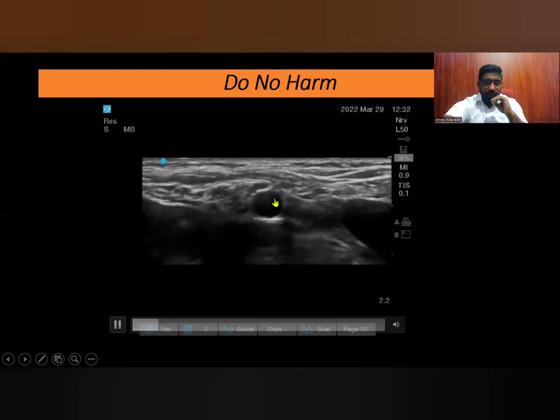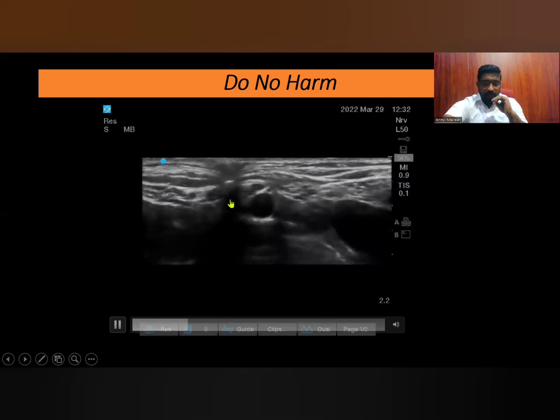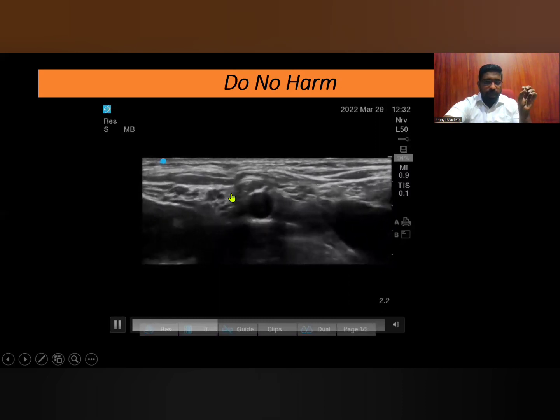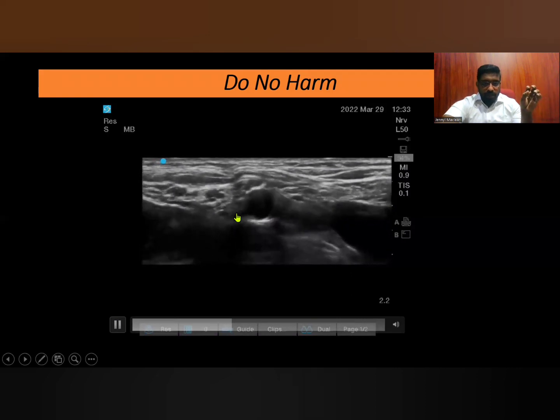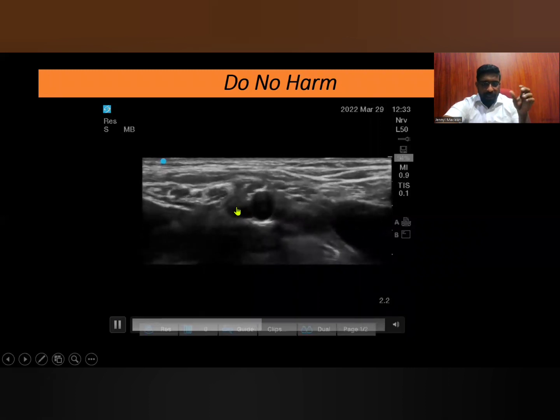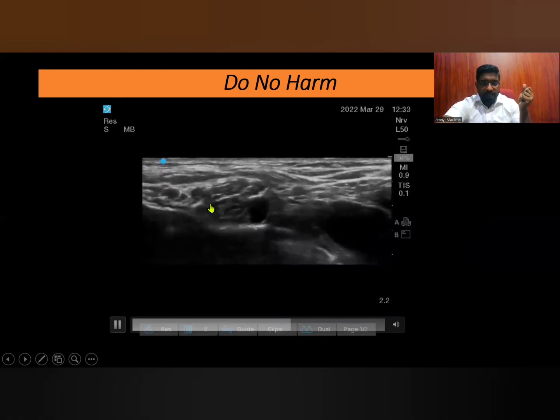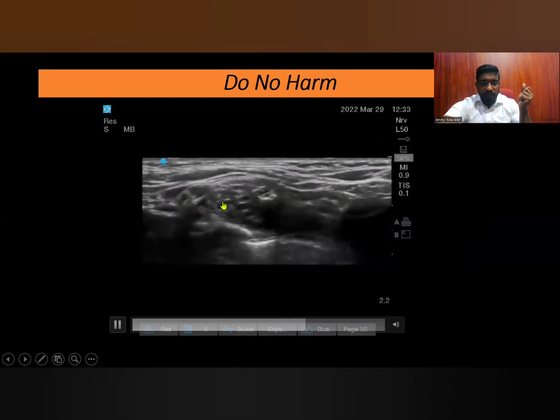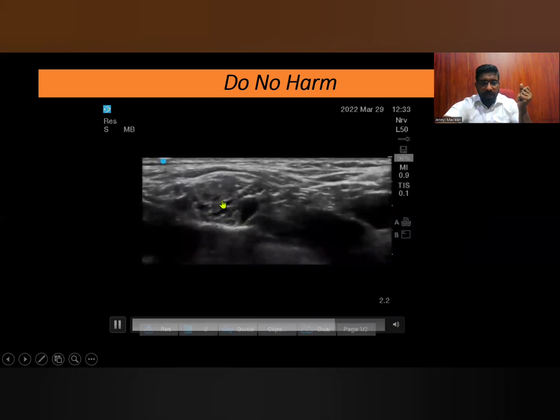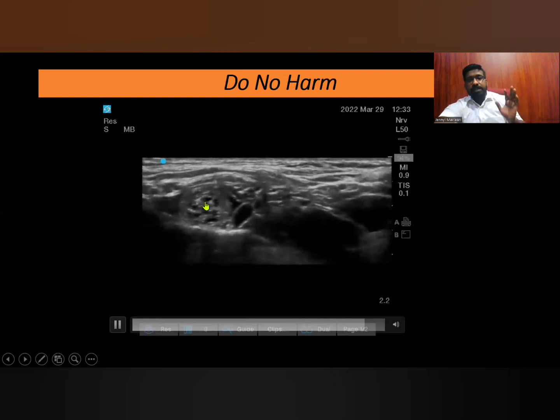You can see the pulsating artery, the subclavian artery. One of my residents is coming out of plane, and after he gives the local anesthetic, you see the distension of the C7 and C8 components. You can see there, the neural elements being distended. Again, he's scouting up and below to identify the needle tip, still not seen. When he comes out, he has totally distended the lower trunk. Again, you can see that. This is what it is.